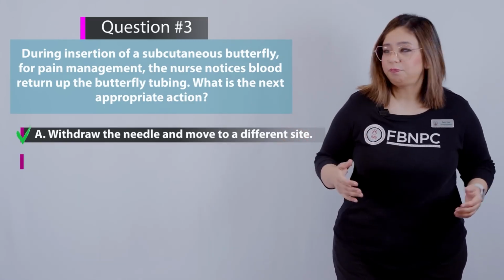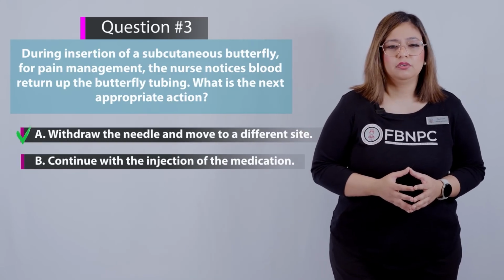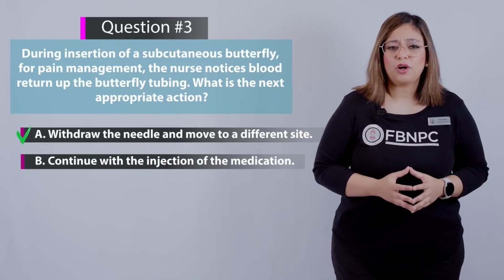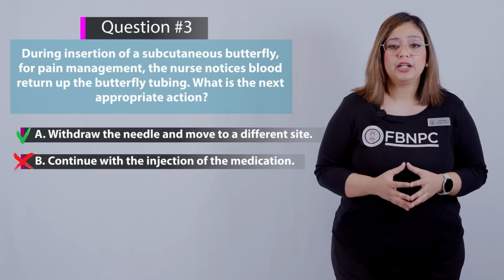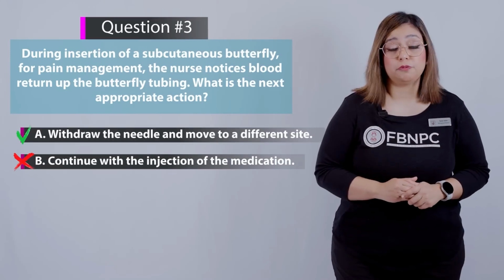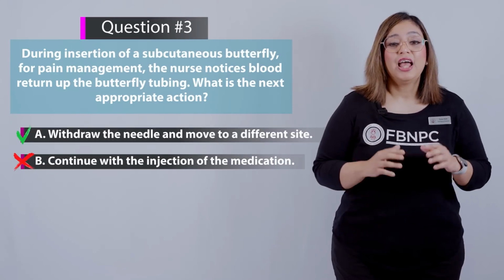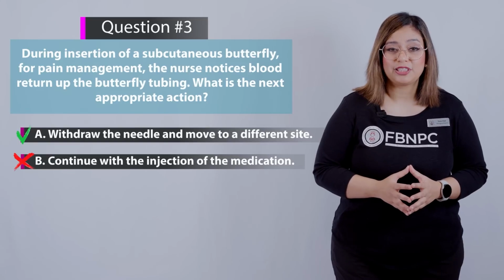Option B, continue with the injection of the medication. Do you think that's advisable? No, that's incorrect. Injecting medication directly into the vein can lead to adverse reaction and is not the purpose of subcutaneous butterfly, which is to deliver the medication into the subcutaneous tissue for absorption.